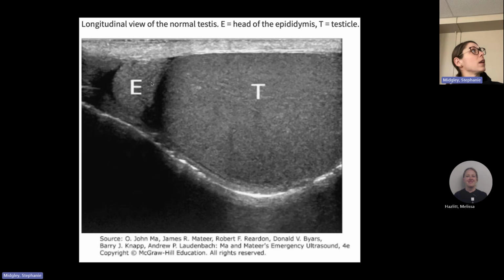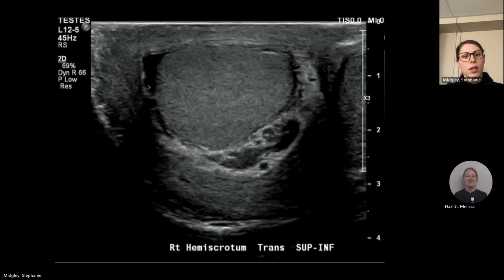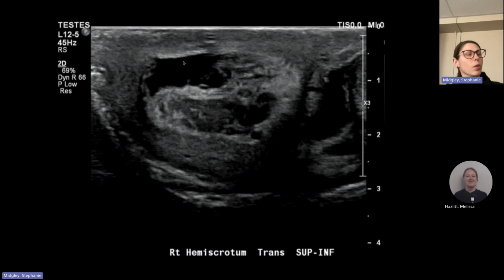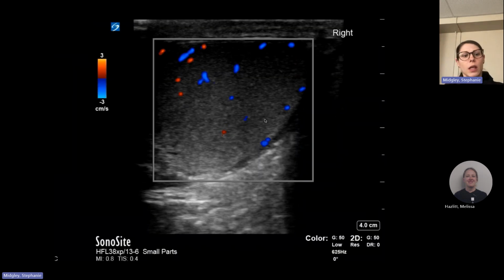Typically on the periphery, you're going to see the epididymis. And then here you're going to see more epididymis. So now we're scanning through the epididymis that's on the bottom. And then as you start to come up more proximal, right here, you're getting up towards the spermatic cord area, and then more of the spermatic cord up here. So this is all normal.